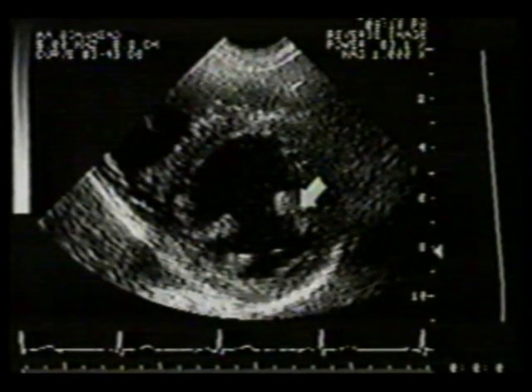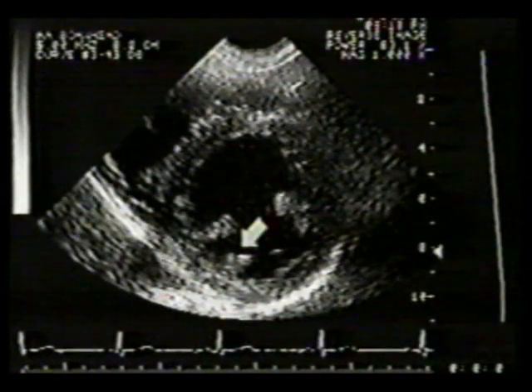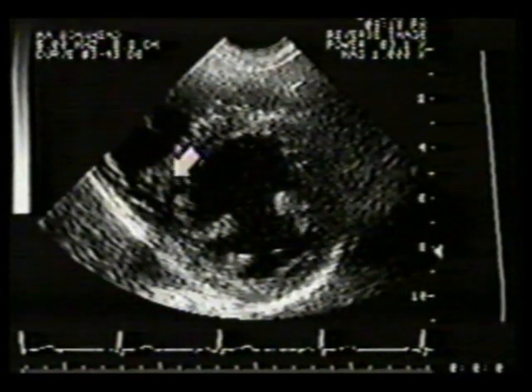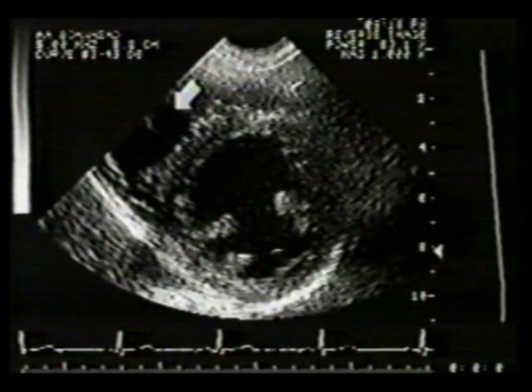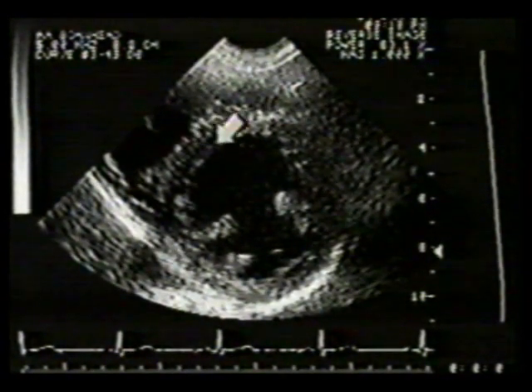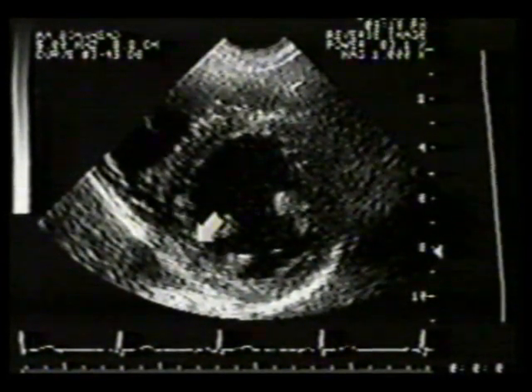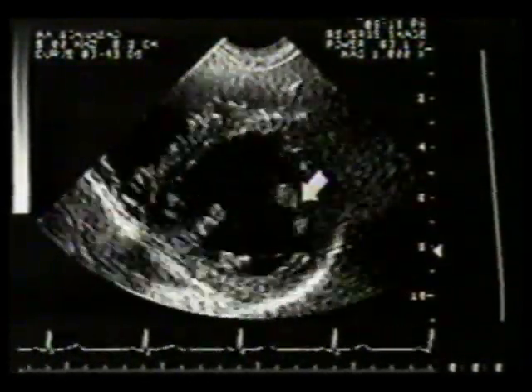This is the anterolateral papillary muscle, and this is the posteromedial. Note that for this subject, the posteromedial papillary muscle has 2 separate heads. The ventricular septum lies between the left and right ventricles. Note that the right ventricle is incompletely visualized. In addition to the septum, the left ventricular segments include the anterior, lateral, and inferior walls. In real time, note the uniform contraction of all left ventricular segments.